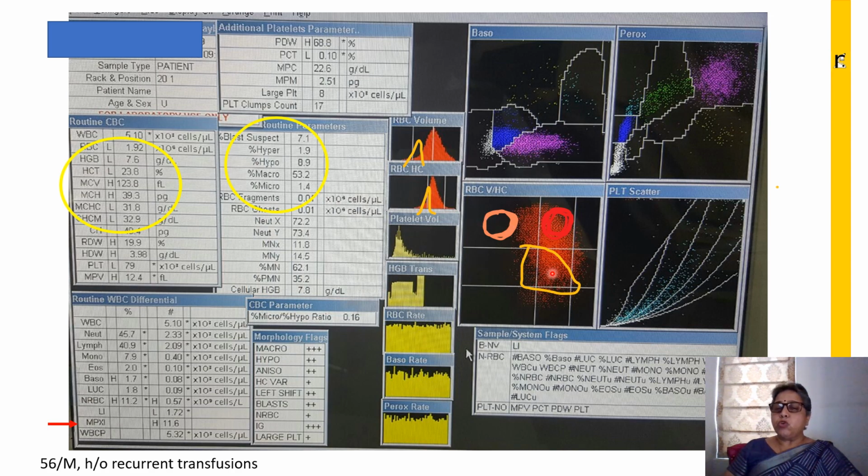The scatter is mostly confined to the center of the grid and a little bit to the right. It does not really go to the left of the grid. This is usually the case of myelodysplastic syndrome. In cases of myelodysplastic syndrome, you will have various shapes of the scatter, and the scatter usually tends to occupy a major portion of the grid.